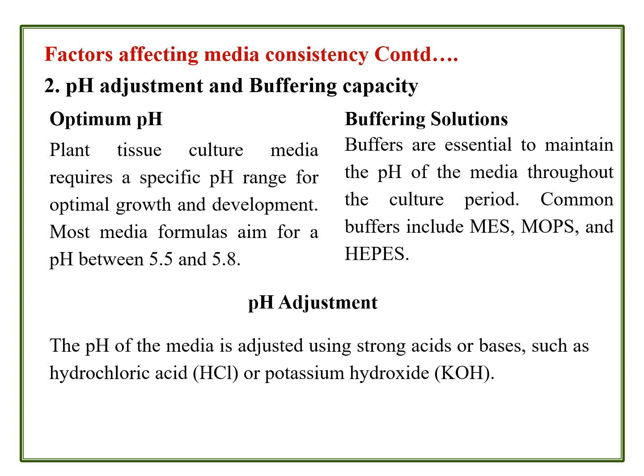Next, buffering solutions. Buffers play a very significant, essential role in maintaining the pH of the media throughout the culture period, because any combinations of the hormones, that is auxins and cytokinins, sometimes an auxin-rich medium, create a variety of acidic conditions, even highly acidic conditions where more dehydration occurs.